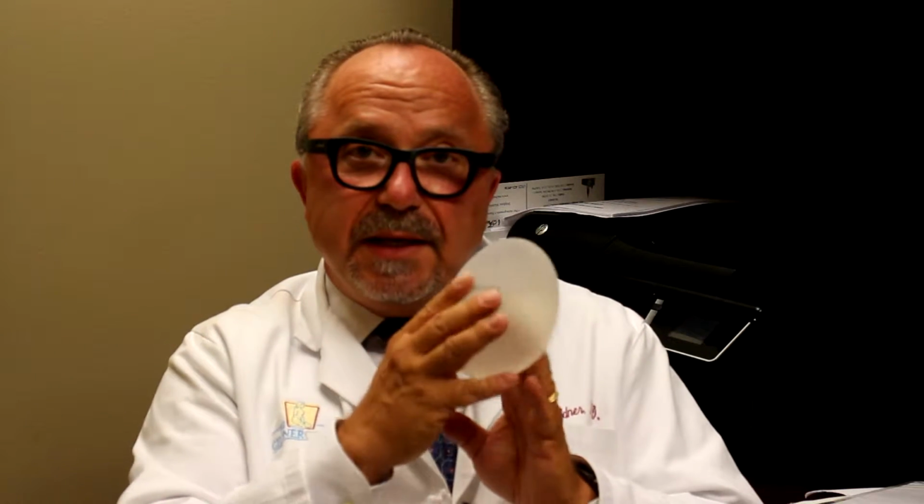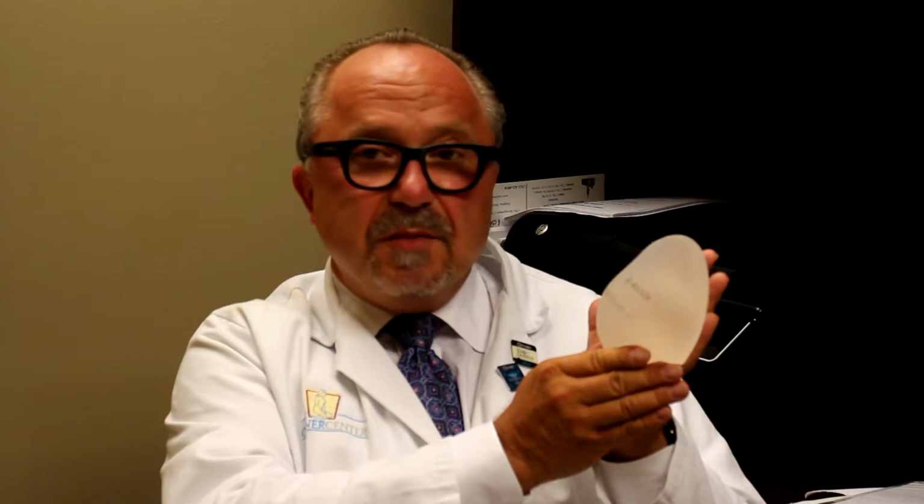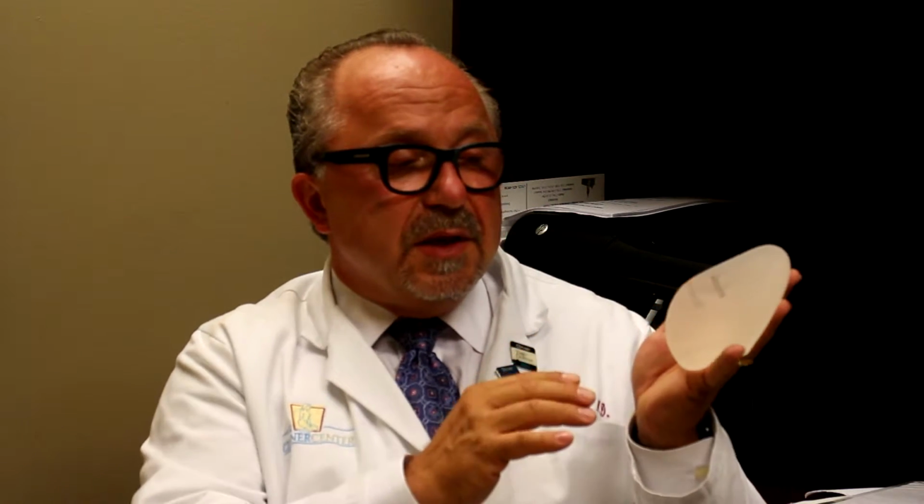So with this kind of an implant, it has a particular shape. And what we see is that when I stand this implant up, we have a little bit of contour irregularity, but not much. So essentially, we're eliminating the rippling at the top.